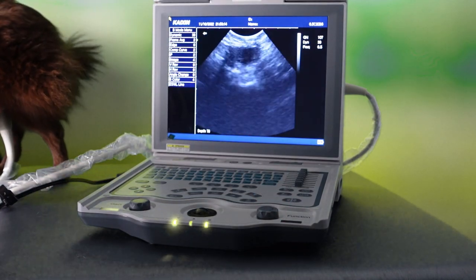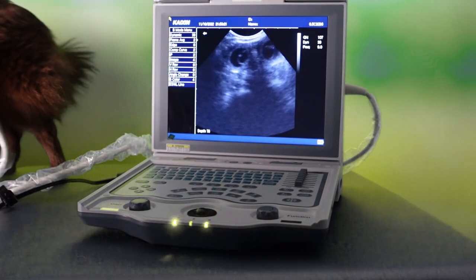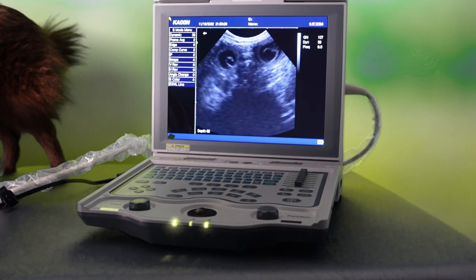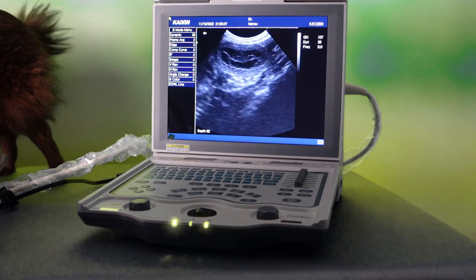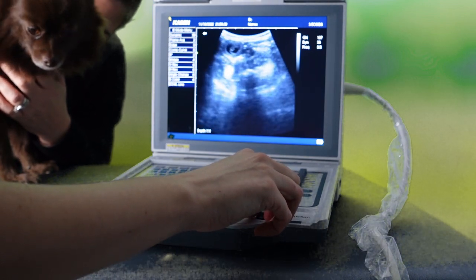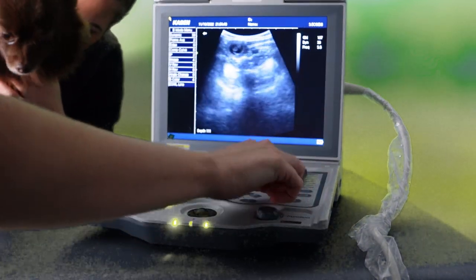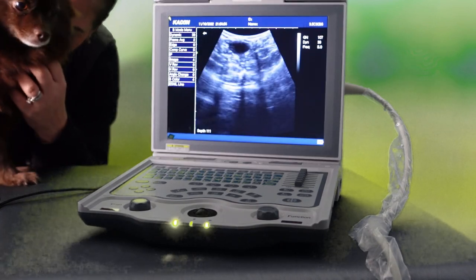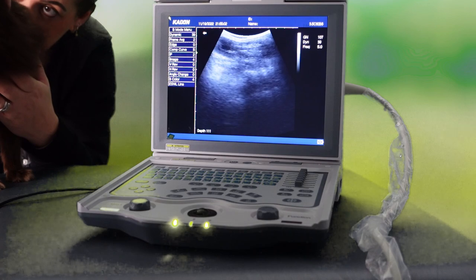Now for the Elite 5600. I'm finding the bladder first and reducing my depth. This is the microconvex probe. Reducing my depth further to really make use of all the space on screen, I can just about catch the tiny flicker of a heartbeat, even at this early stage, with the higher resolution of a microconvex probe. Onto the lower-frequency convex probe now. The main drawback is that I just cannot reduce my depth enough to make use of all my on-screen space with this smaller animal. I also found that although the most common argument for using a convex probe is that it makes it easier to get more on screen in one go, the lack of manoeuvrability actually made it more difficult to get the two foetuses in one image than it was with the microconvex probe.